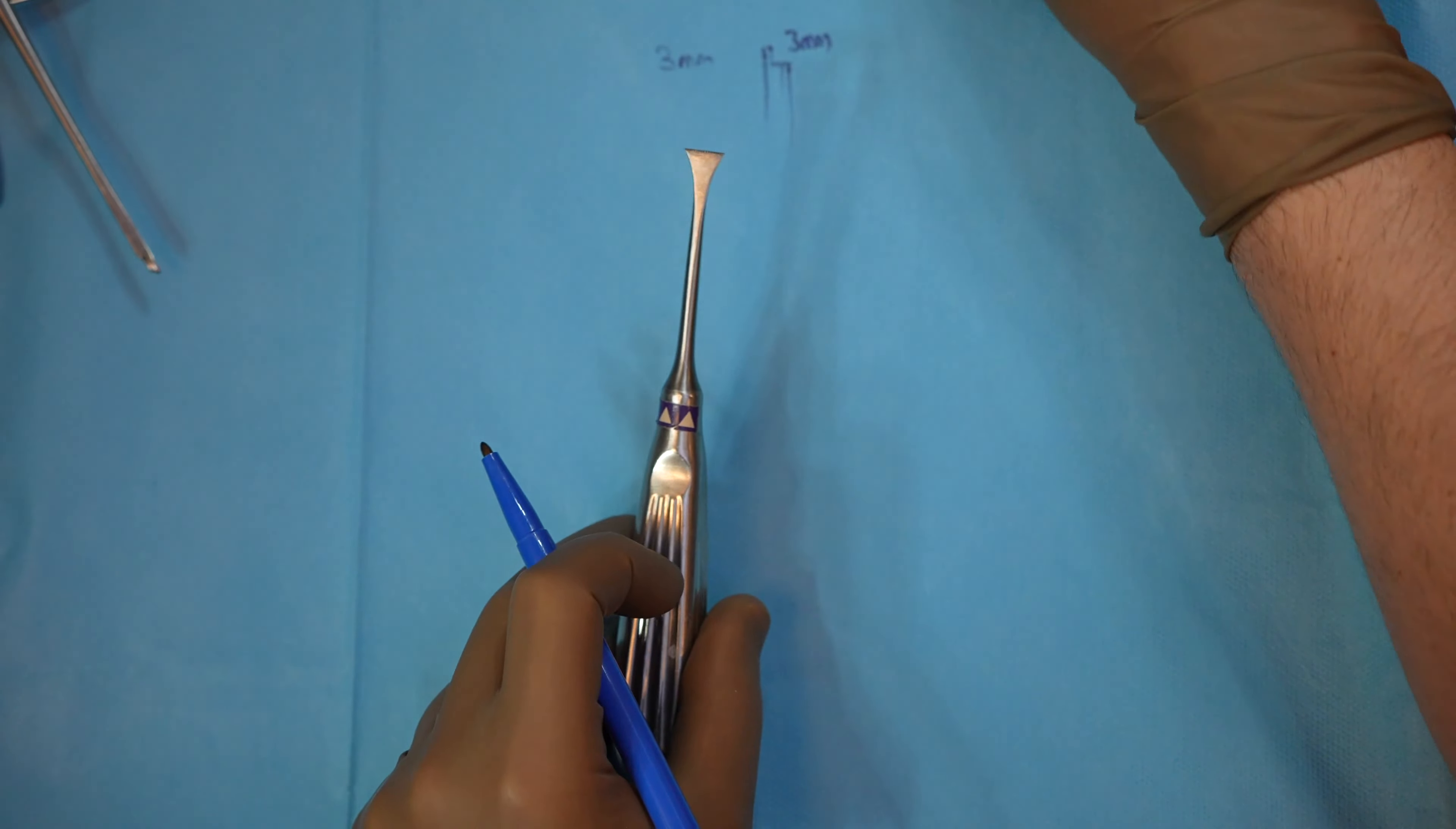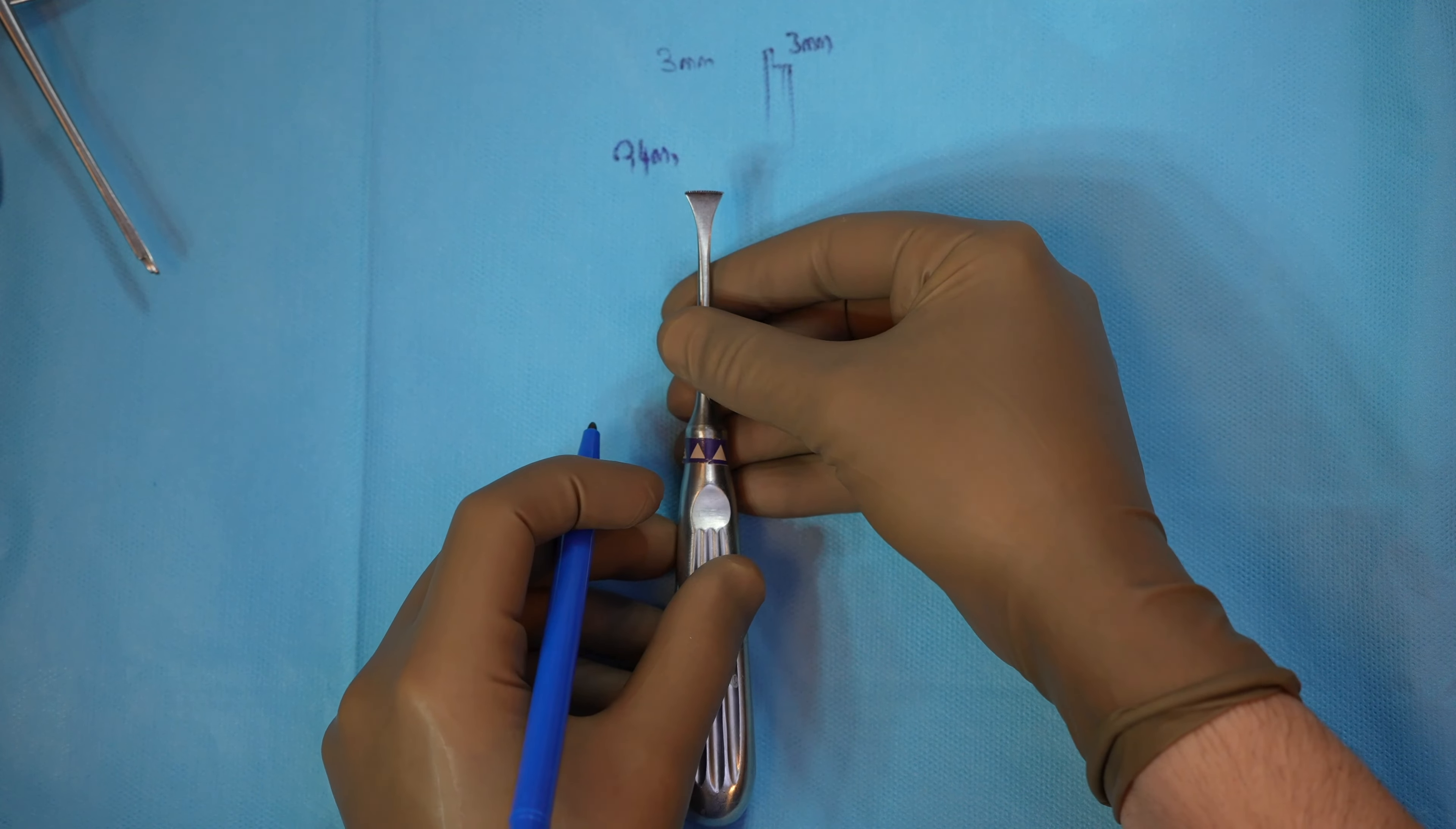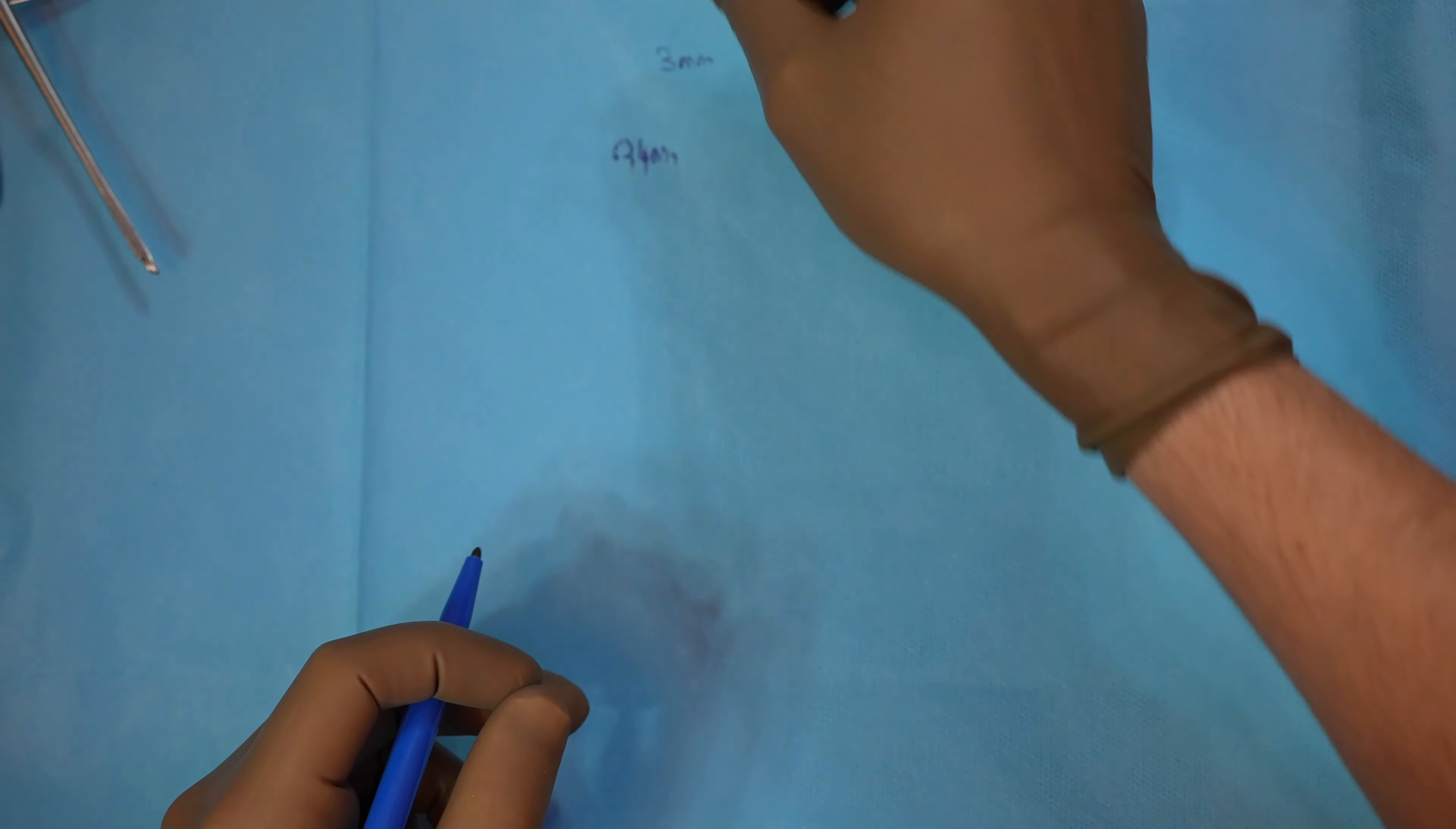This is Tashtan convex saw, 0.4mm, thinner than piezo. If I dissect everything on the bone, I use this for transverse osteotomy.